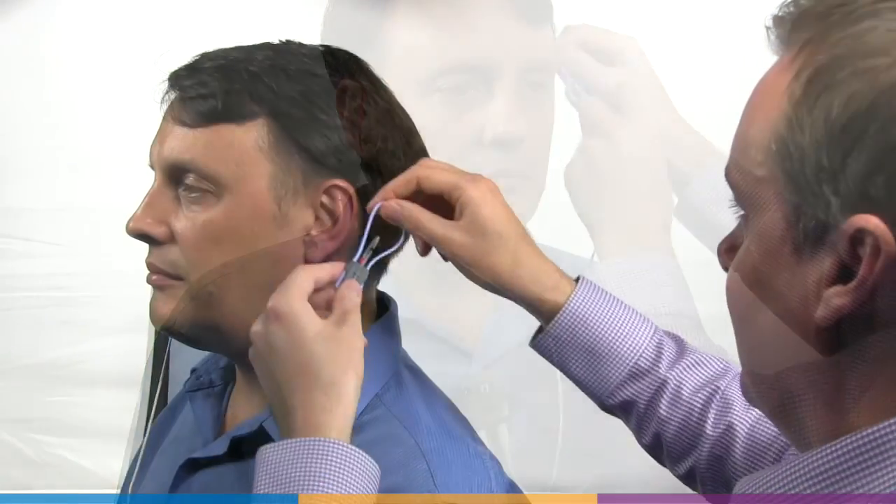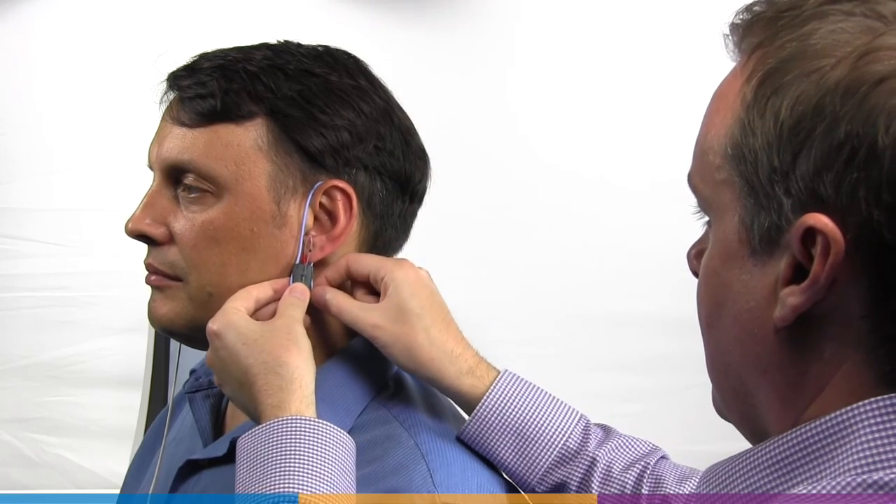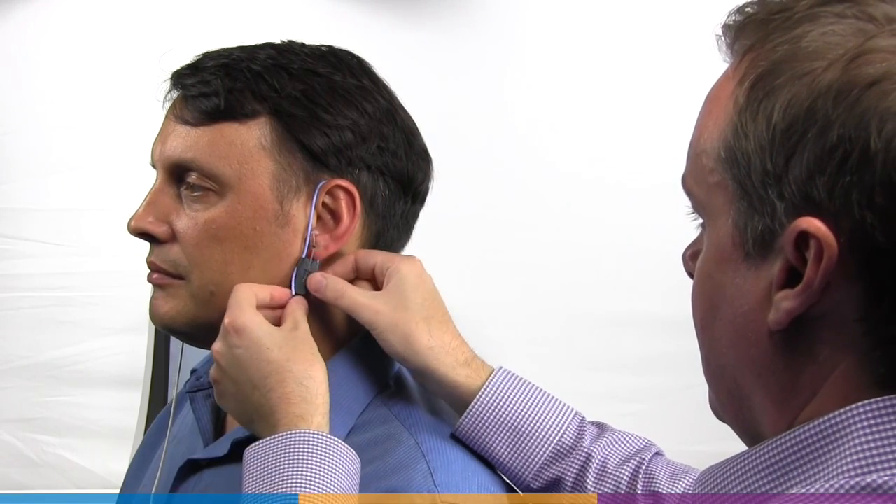Hang the probe microphone on the ear as shown. The reference microphone should face outwards. Adjust the blue or red lanyard until the probe microphone module is snug against the head, at cheek level, directly below the earlobe.